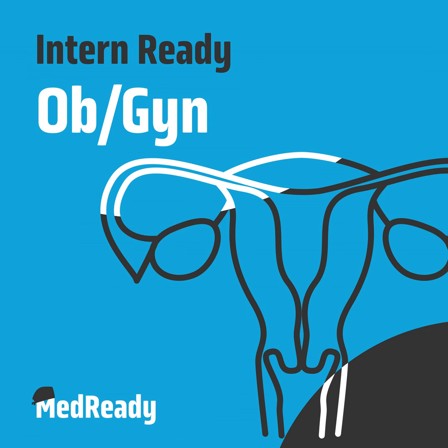Yeah, so there are a few components of a hysteroscope. Obviously, it will be a lot easier for you to understand when you're looking at a hysteroscope. So my biggest tip before I go into all of these is, when you're in the OR, try to go a little early and see if your scrub tech will show you how to put the hysteroscope together so that you're a little more familiar with all the parts. But in big picture, the components of a hysteroscope are, one, the actual telescope.